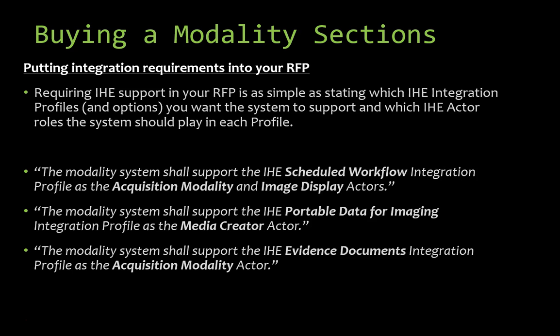Here are some sample statements you might want to put in your RFP. For each of the profiles we've talked about, you want to have a corresponding statement to include that profile in your RFP. So you might put something in there like, the modality system shall support the IHE scheduled workflow integration profile as the acquisition modality and image display actors.